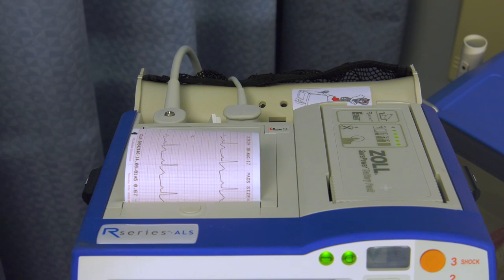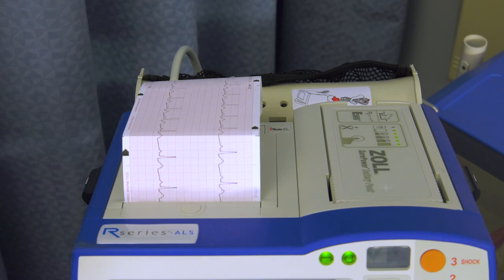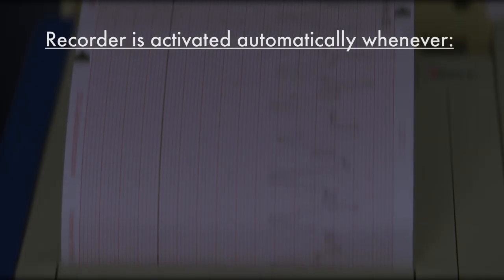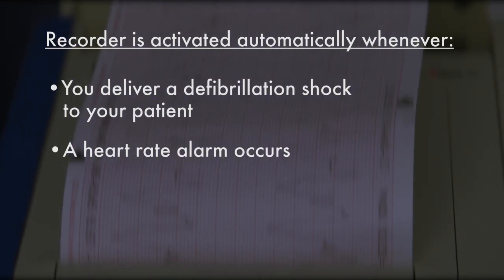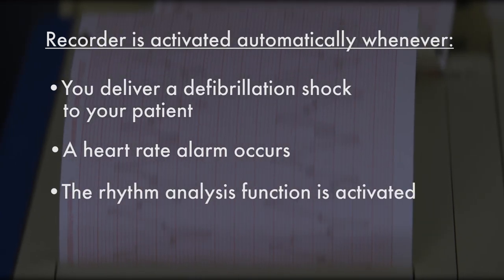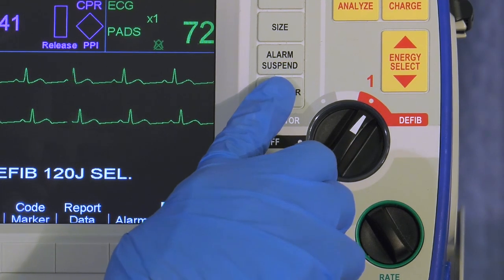The printer operates with a delay of six seconds to ensure the capture of ECG information immediately preceding critical events. The recorder is activated automatically whenever you deliver a defibrillation shock to your patient, a heart rate alarm occurs, or the rhythm analysis function is activated. You can manually activate the recorder at any time by pressing the recorder button. Press it again to stop printing.